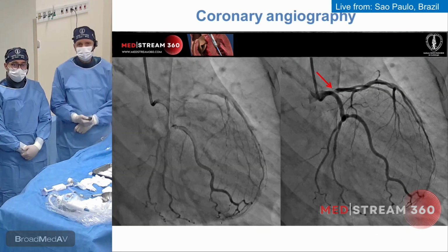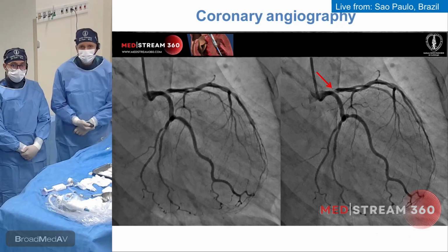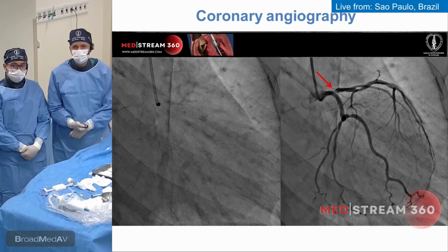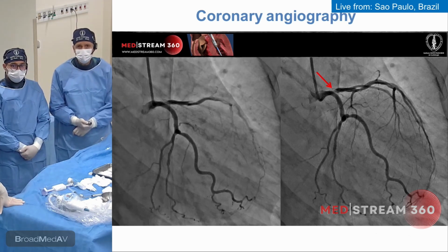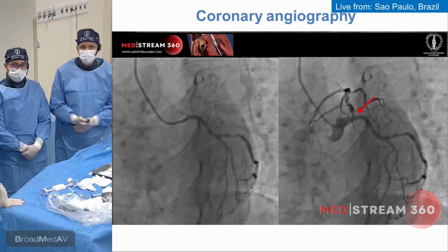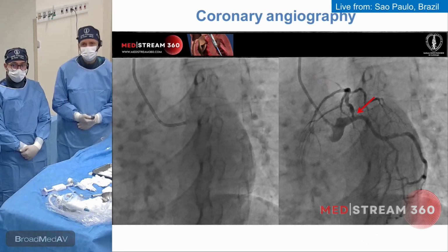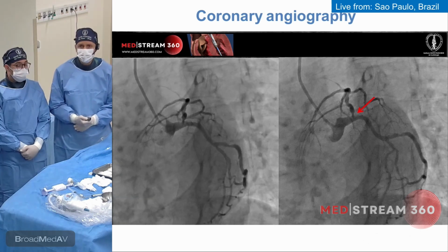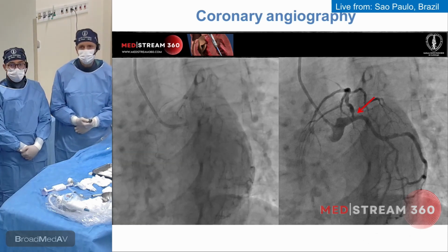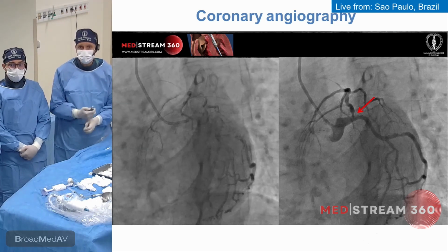It calls the attention already some degree of calcification, proximal LAD. There's a mild to moderate disease in the first OM branch. There's some haziness at the very ostium of the LAD. That's a place where the calcium. You see here a tight stenosis at the very ostium location. It doesn't appear to involve the circumflex. It doesn't appear to involve the ostium and the proximal circumflex as well, and left main.